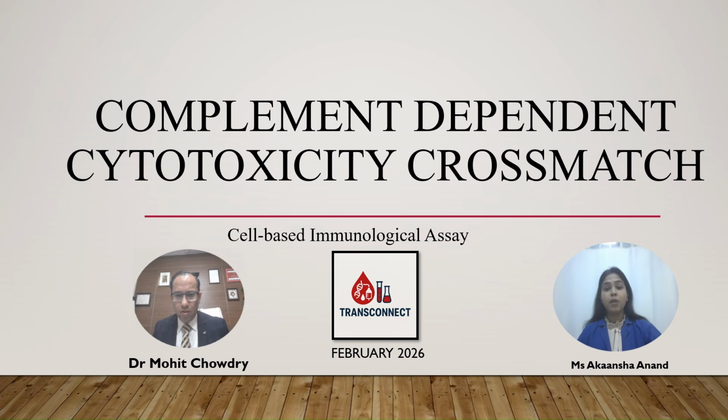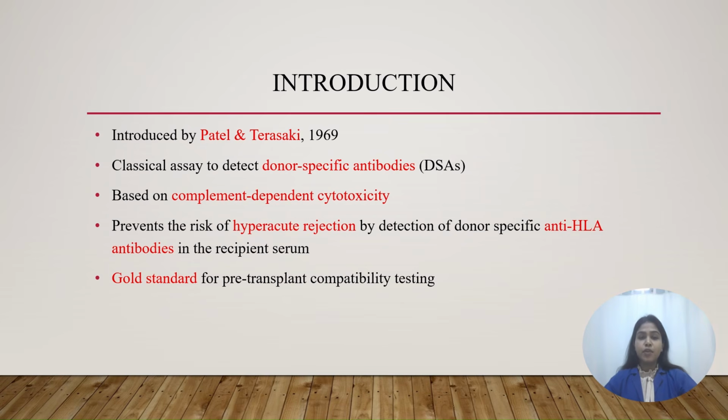Today we'll talk about a cell-based immunological assay, a silent test that predicts whether the graft will survive or be rejected within hours of transplant. That is the CDC crossmatch. CDC stands for complement-dependent cytotoxicity, an immunological assay that was introduced by Patel and Terasaki in 1969. It is a classical assay used to detect donor-specific antibodies.